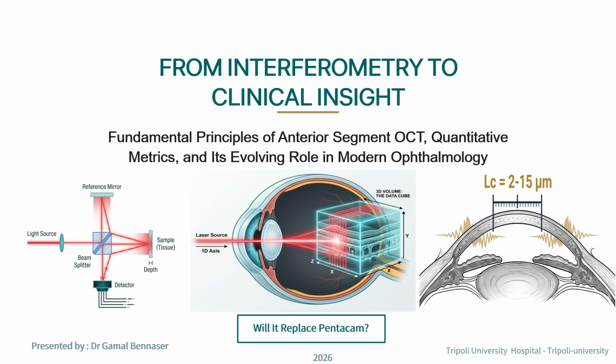And the second session will be some clinical examples and the clinical applications of this technology. And finally, we must speak about the newly evolving technology that combines the Scheimpflug technology along with the anterior segment OCT, this hybrid technology, which is known as the Pentacam anterior segment OCT.